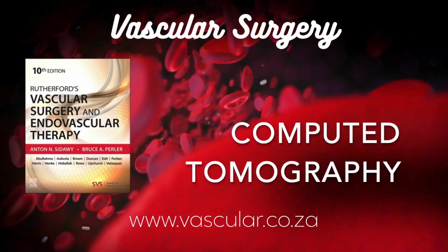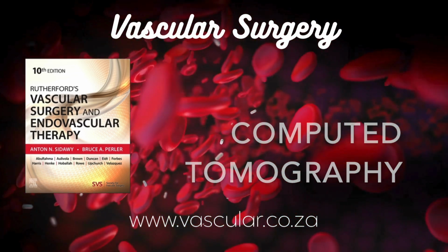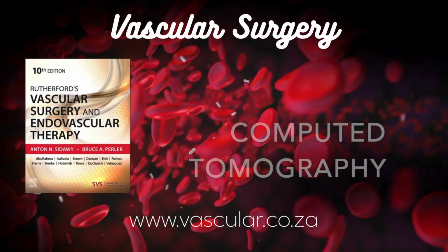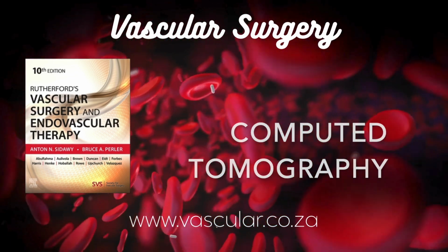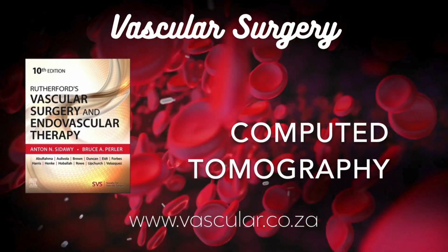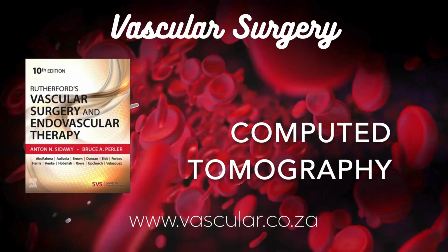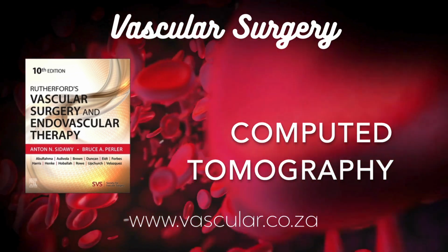Why do that? Fewer images to look at. Exactly. It reduces the initial image count, making review faster. But because you still have the raw data, if you see something interesting or need more detail in a certain area, you can always go back and reconstruct images closer together, say every 1 millimeter, or even overlapping at 0.5 millimeter increments just for that region. Flexible. What about the slice width or thickness itself? You can also choose the thickness of the reconstructed slices. Again, using that raw data, you could reconstruct 1 millimeter thick slices for fine detail, or maybe thicker 5 millimeter slices. Why thicker? Thicker slices average more data, which reduces image noise, making them look smoother.